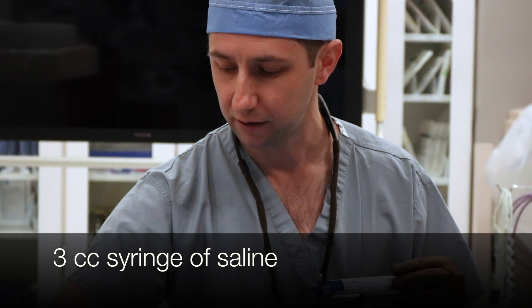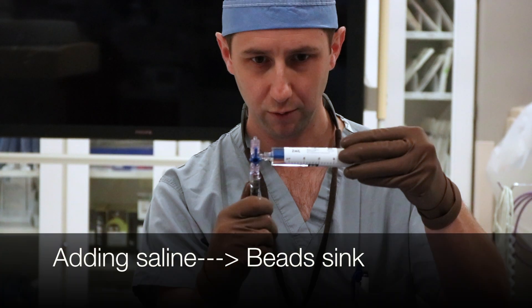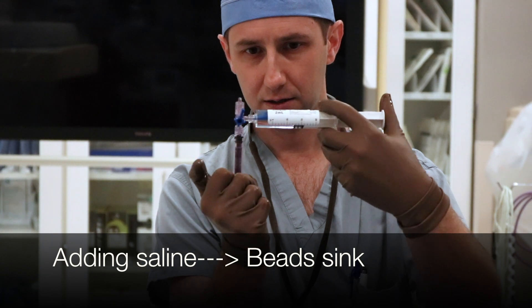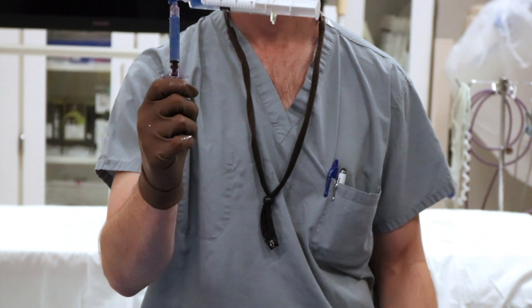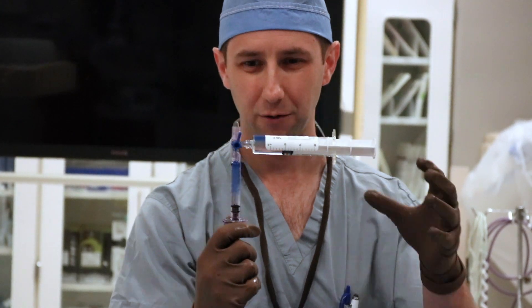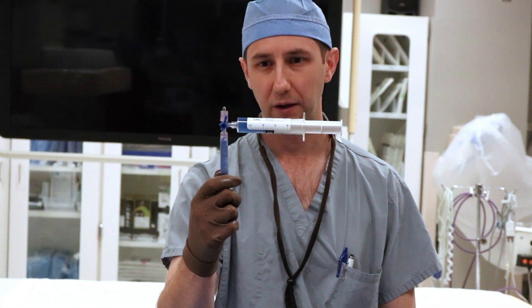We'll take a three cc syringe, which we can use to deliver the embolic, and put in a little saline. You want to purge out a little bit of the air, then throw in a little bit of saline and agitate between the two. You should get your beads to hold right in the middle of the suspension, maybe a little bit towards the top. Push those in.